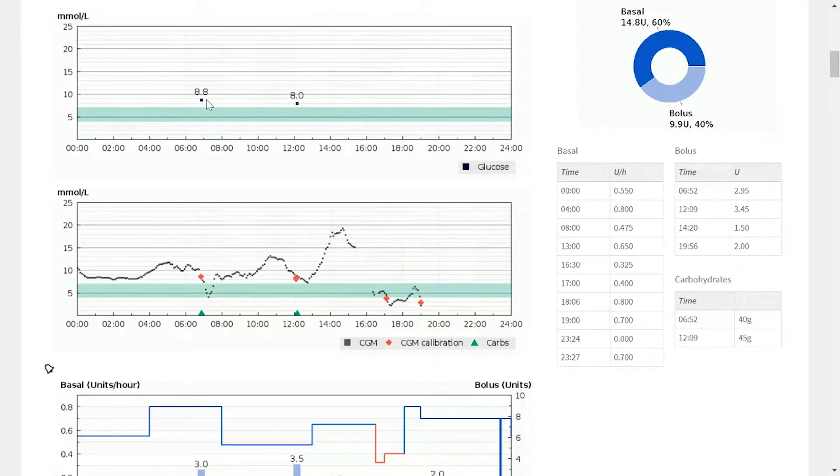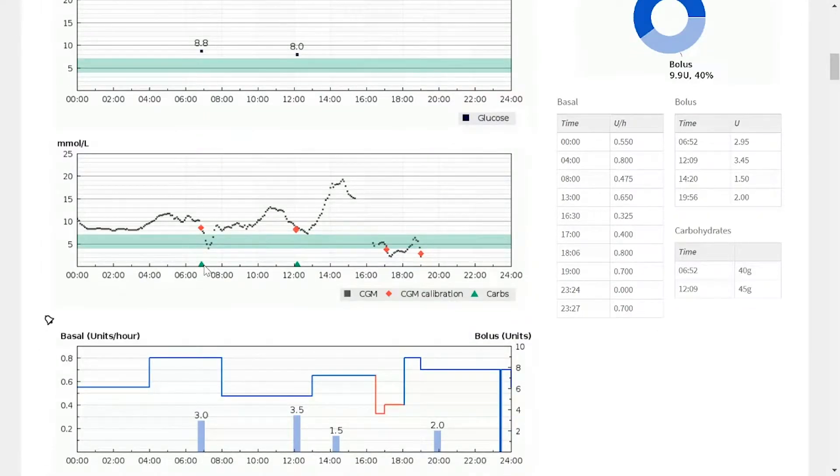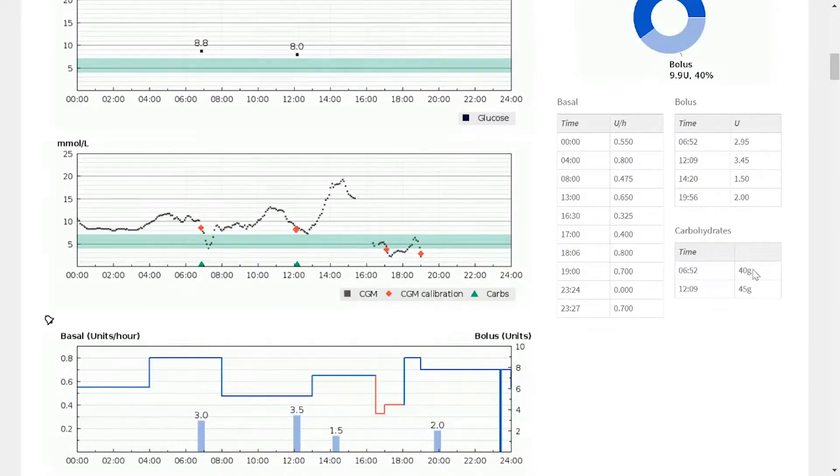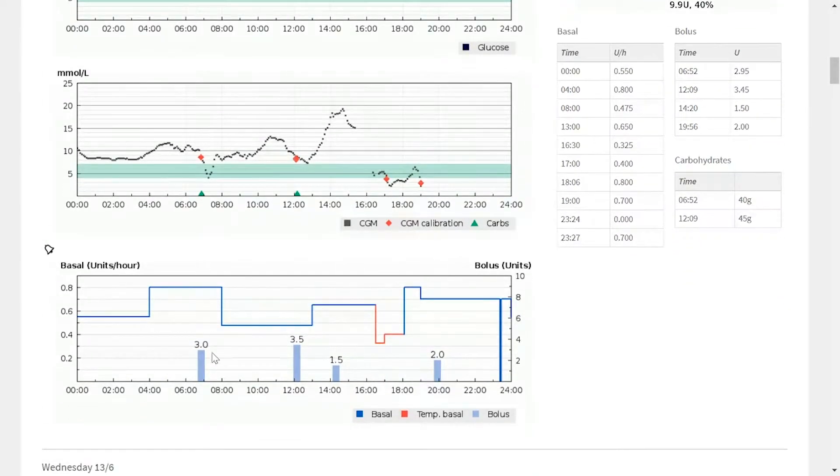So we can see for instance this patient has had an 8.8 reading at the same sort of time that they were having carbs. The amount of carbs can be found on the right hand side, so at this case it was 40 grams. So when the patient had an 8.8 blood glucose and 40 grams of carbs, they had a bolus of three units.